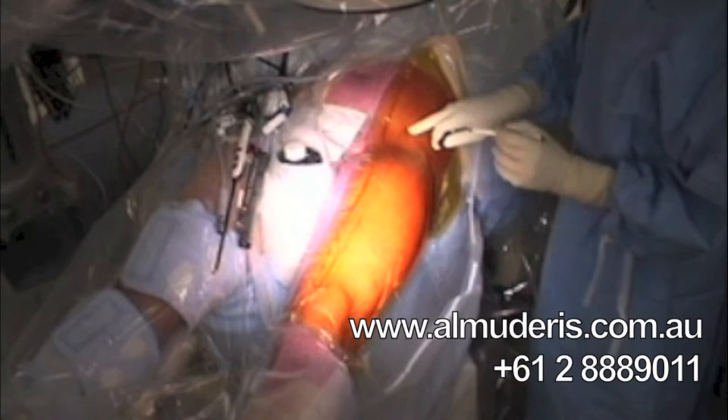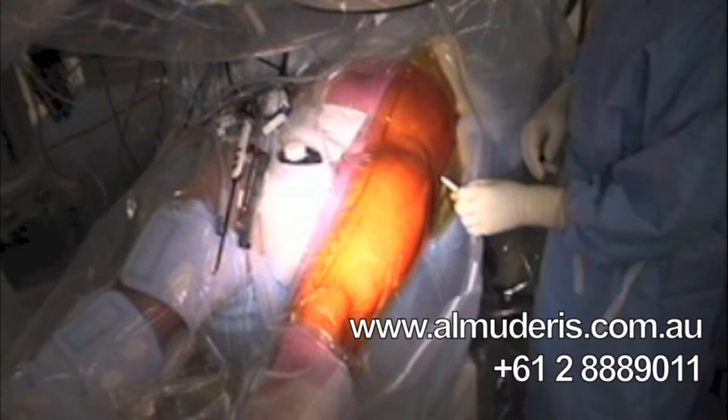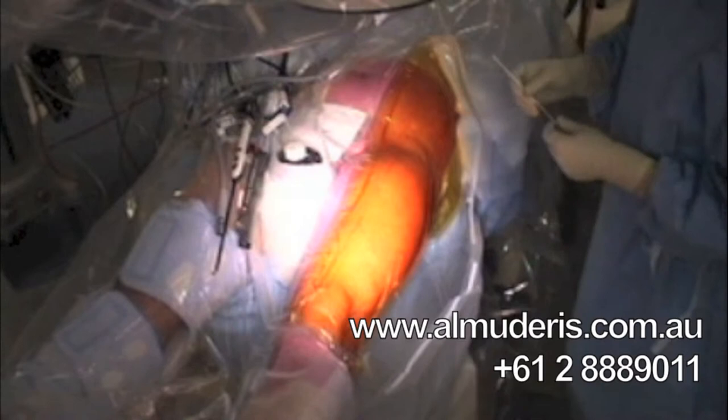My entry points will be somewhere in the upper lateral quadrant, anteriorly for the anterior portal and just anterior to the greater trochanter for the camera portal. We start the operation with image intensifier. I perform this operation accessing the femoral neck first.